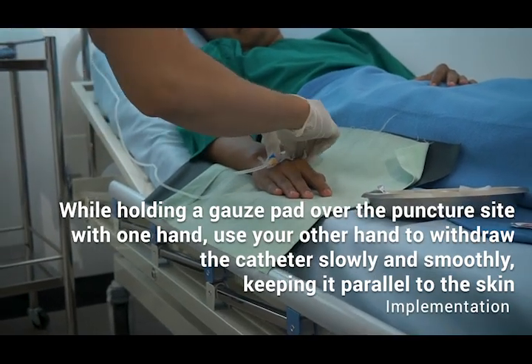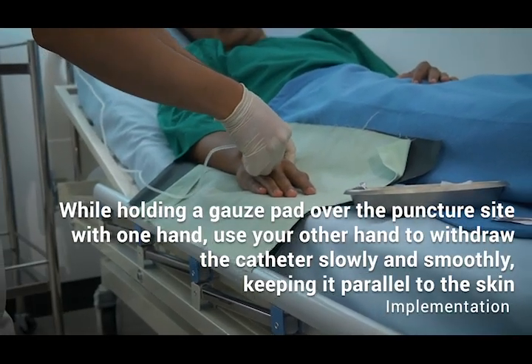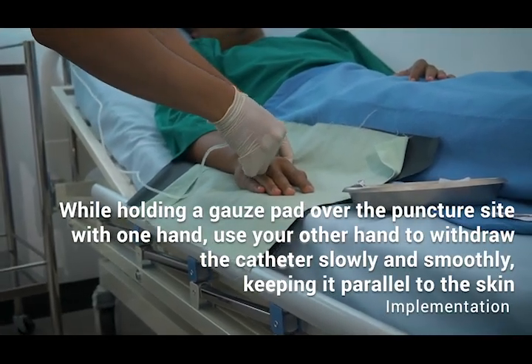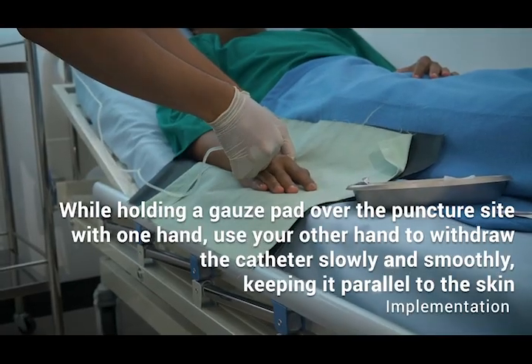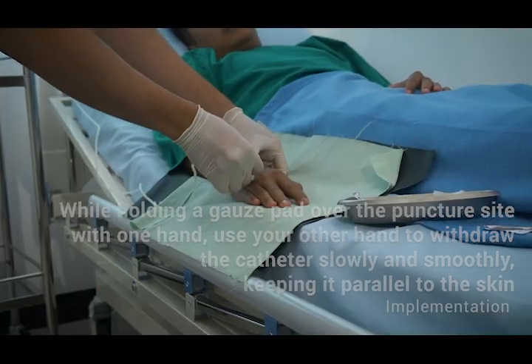While holding a gauze pad over the puncture site with one hand, use your other hand to withdraw the catheter slowly and smoothly, keeping it parallel to the skin.